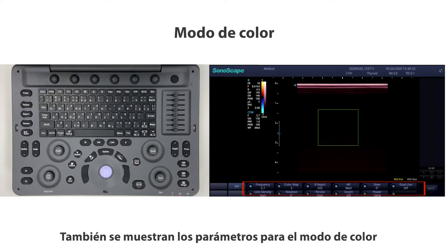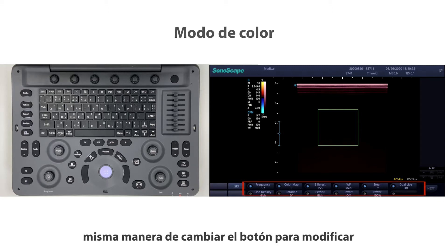Parameters for color mode are displayed as well, and you can switch the button the same way to modify them.